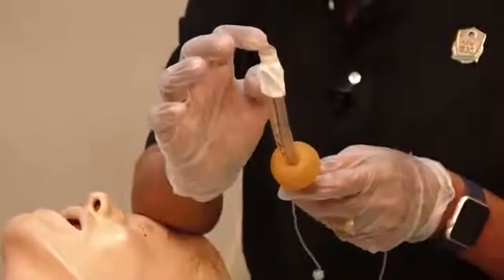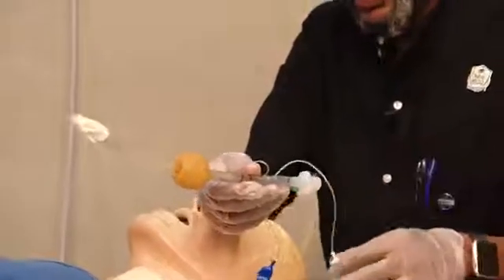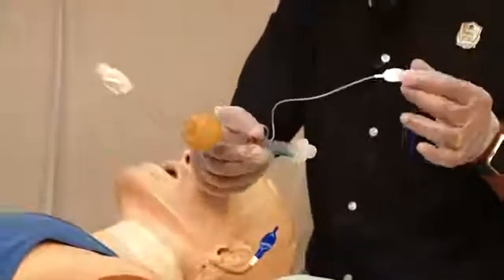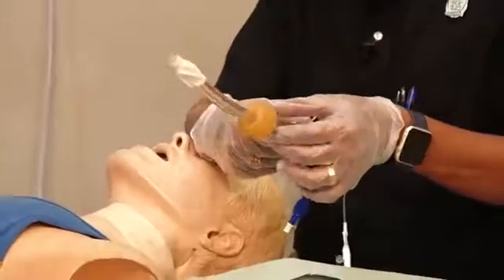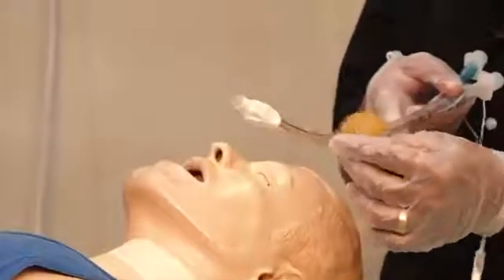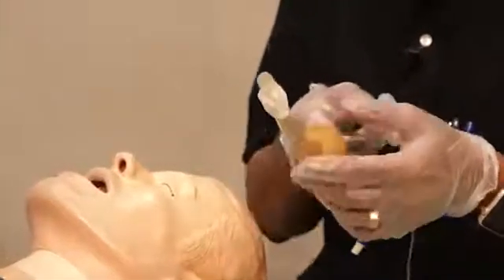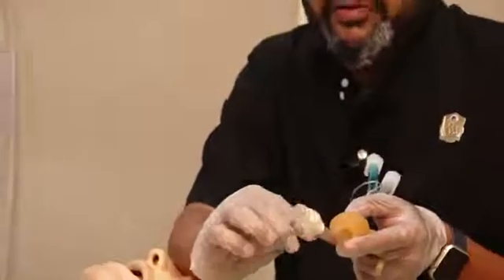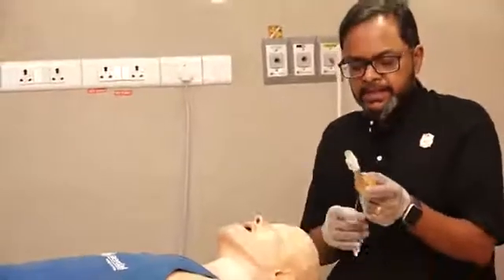Now looking at tube number two: similarly there is a universal connector, a pilot balloon with a white balloon, then a marker, then the balloons. Tube number two has no openings anteriorly or posteriorly along its shaft. In contrast, tube number one has four openings on the back side and four on the front side, and the tip of tube number two is open.